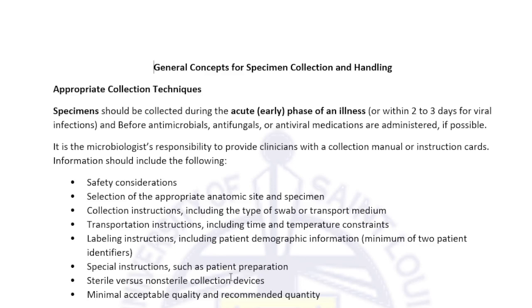Minimal acceptable quality and recommended quantity. So there are cases na it requires a minimum volume of samples. Meron din before sa AFB staining, kapag salivary, hindi daw i-accept. Okay? Pero noon yun, na iba na modify.